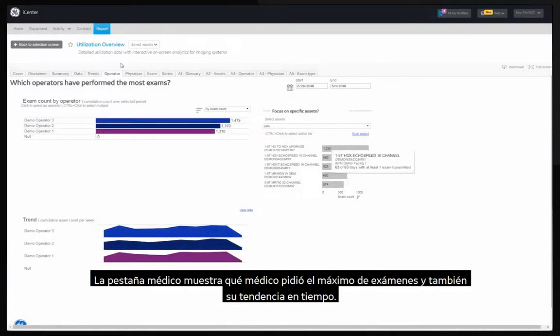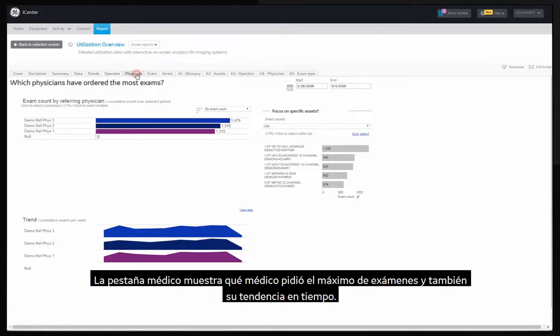The physician tab shows which physicians ordered the most exams as well as trend in time.